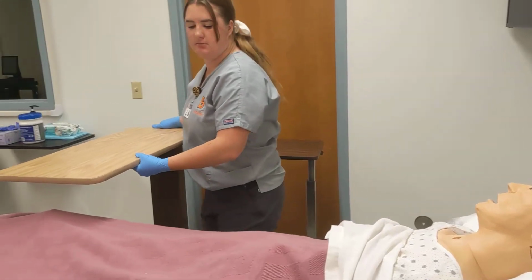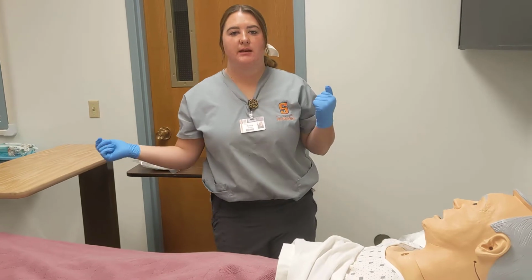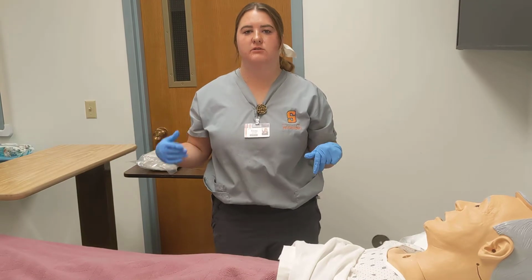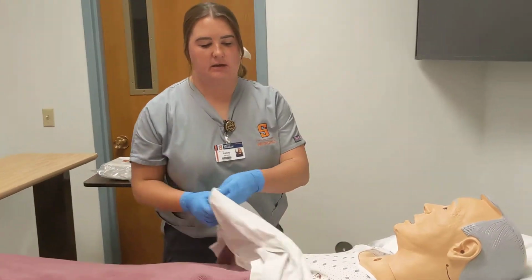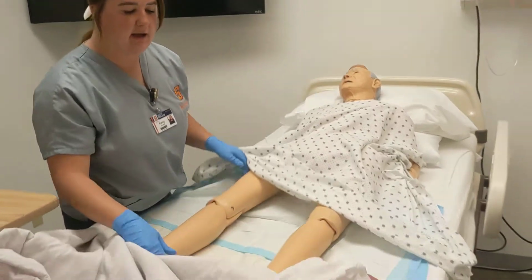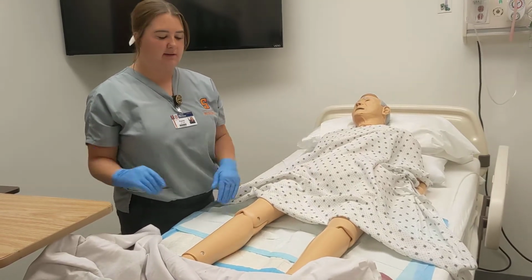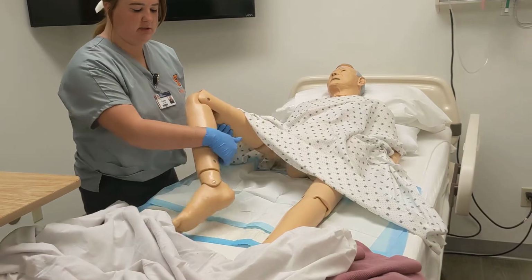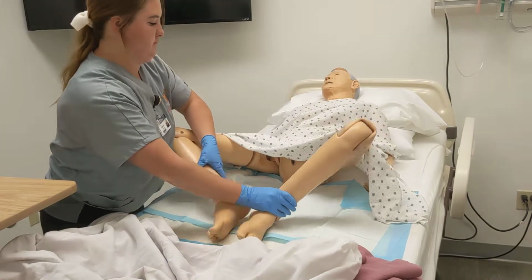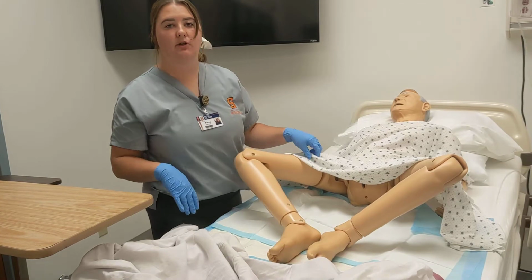So what we're going to do next, we'll move this a little bit more. Okay, so now that we have that moved up, now I am going to help the patient get into the position that will help me be able to insert this catheter the easiest. So I'm just going to help the patient to move their legs. I'm going to ask them to put their feet together and then their legs to just butterfly down, and that should be in the right position. Okay, so the patient is now in the correct position.